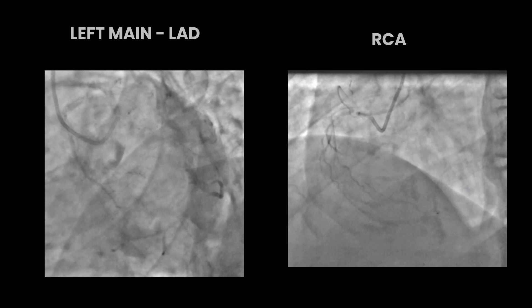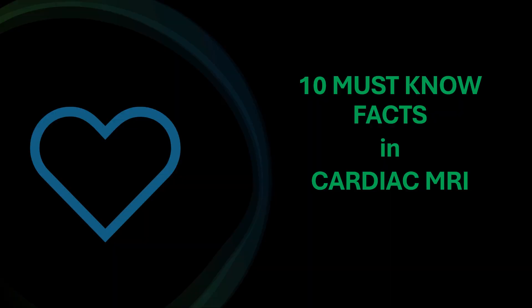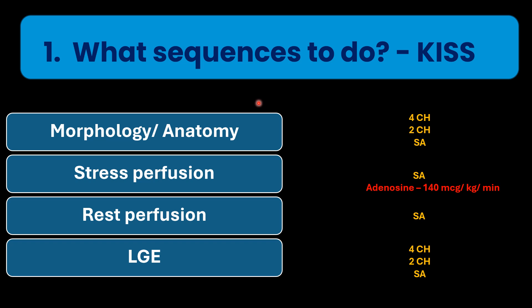In this patient, the inferior segments of the heart are supplied by the LCX rather than the RCA territory. A few important things to know in cardiac MRI: first, what sequences to do. Keep it simple and short — we do only four sets of images. One is morphology/anatomy: the four-chamber, two-chamber, and short axis views, which help identify the morphology and anatomy.